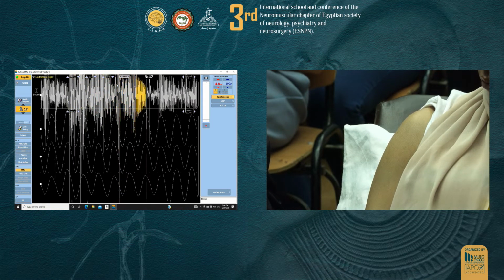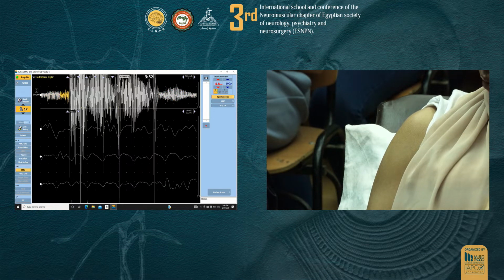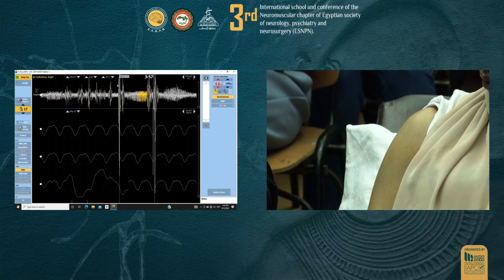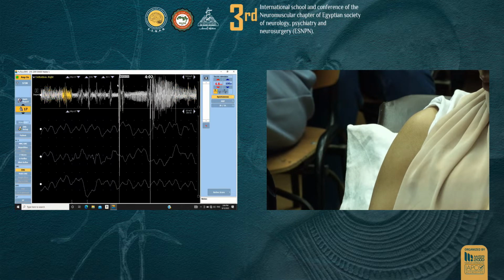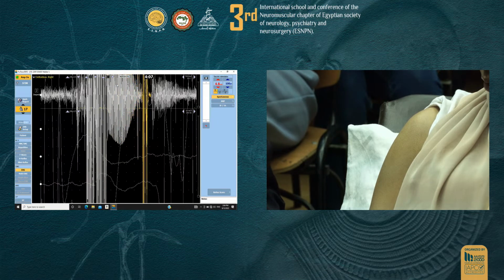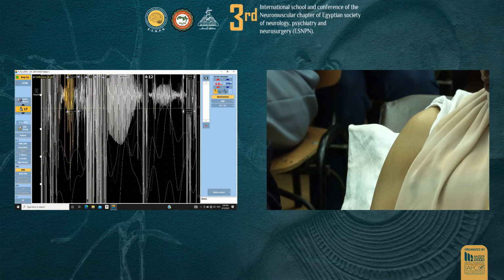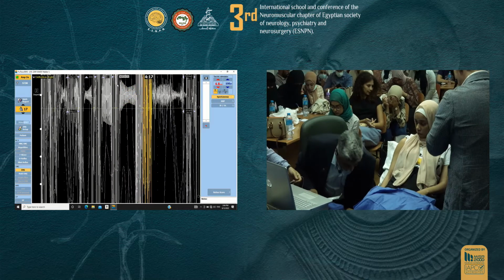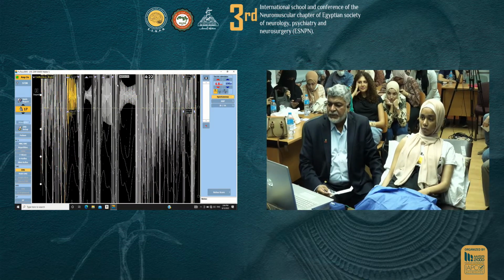No, no, no. The green one. Do you have the green one? What size is this? That's 50 millimeter, 35. That's 37, sorry, 37. Yeah, maybe. Let's see. We'll try different electrodes and different needles to see. This one. It's a disaster. No, it's not working.